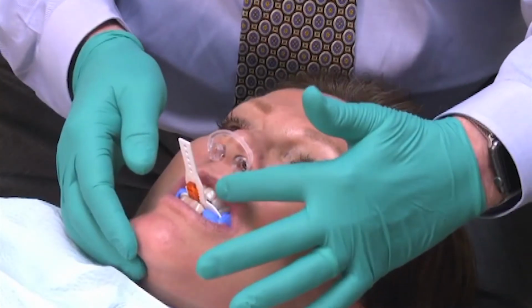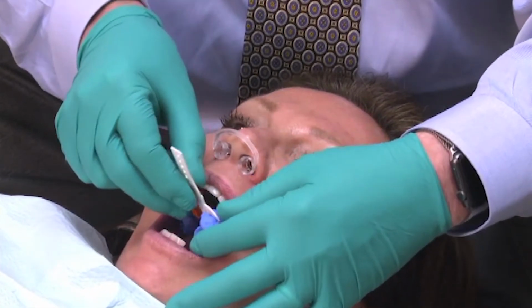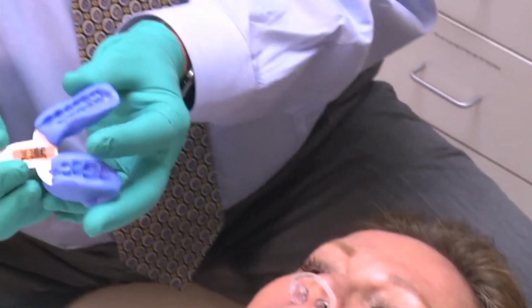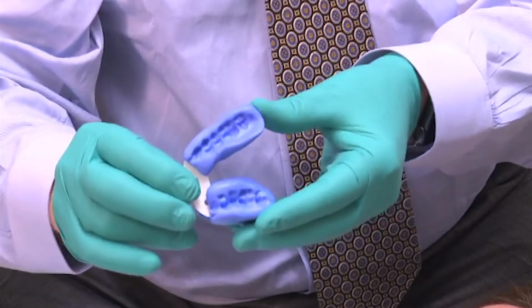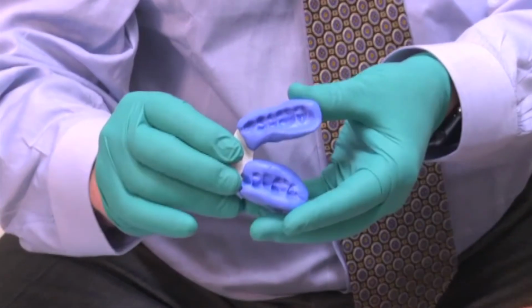So our timer's gone off. We'll verify the putty is set and go ahead and open, Kim. We'll remove our Airway Metric's bite. The handle comes off. That stays behind. The key stays off and stays behind. And once again, those are not autoclavable. And you can see we have our nice bite registration.